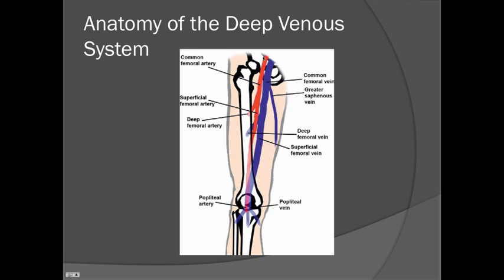One thing to keep in mind here as a landmark is this common femoral artery, which is going to be running lateral to your common femoral vein. And if you've ever heard the mnemonic NAVAL, which says nerve, artery, vein, empty space, lymphatic system, going from lateral to medial, that's a good way to keep in mind the order in which you should see the vessels in this region here. So always be looking for that femoral artery lateral to the common femoral vein.